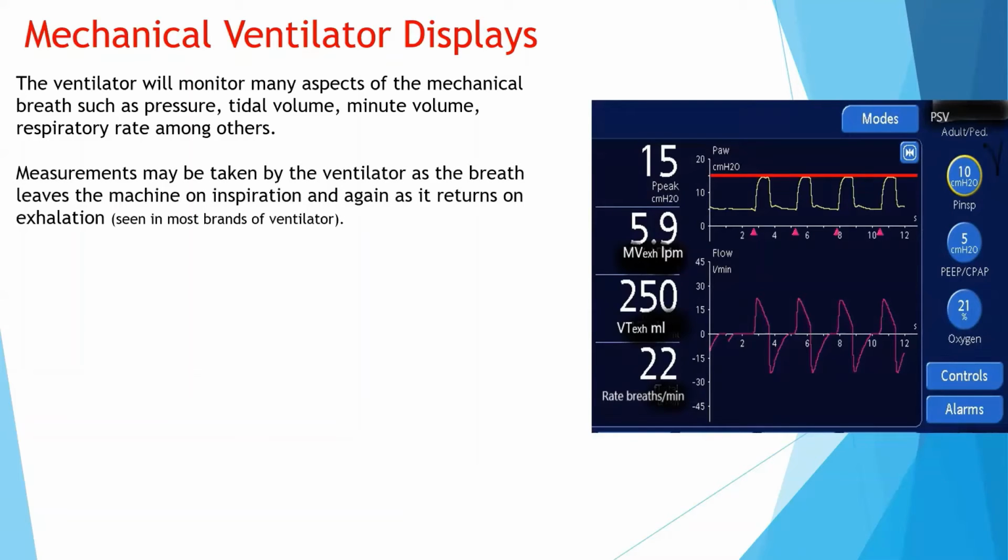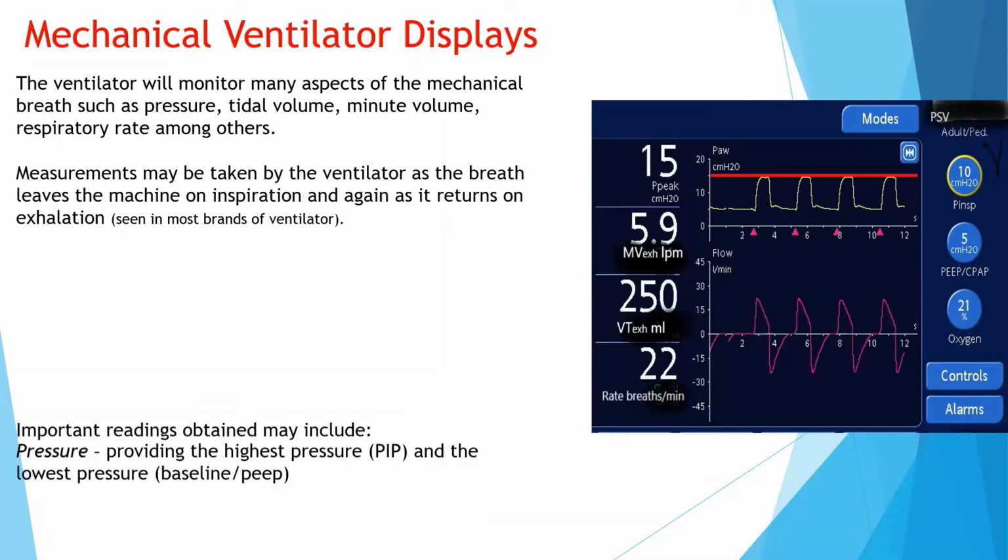So measurements taken by the ventilator can occur as the breath leaves the ventilator, and they can be measured as they return to the ventilator, as seen in most brands of ventilators.